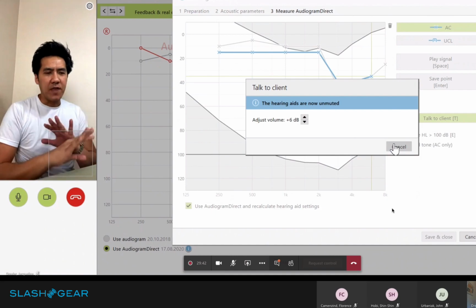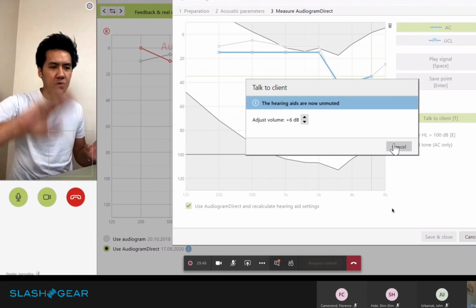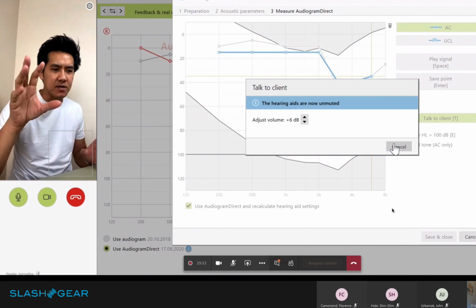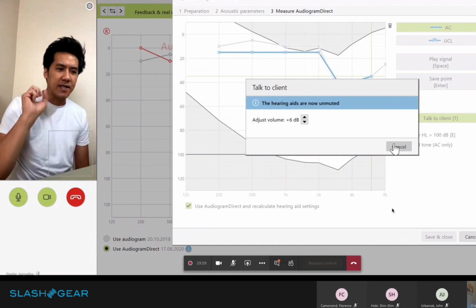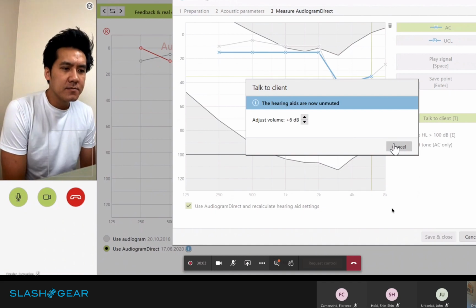So if they can, during the test, somehow just completely mute, because there's the rustling and I think the static from the speaker coming out as well. So I was fighting between that and trying to hear it, and it would cut in and out the sound. So it's a little bit distracting. Okay.